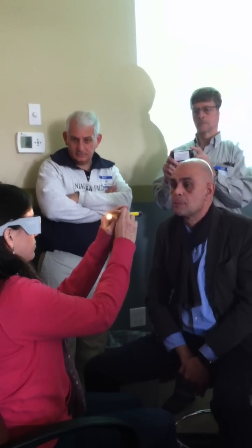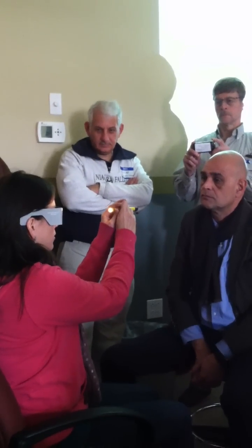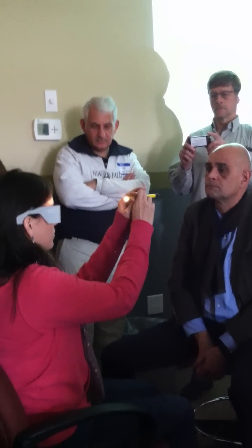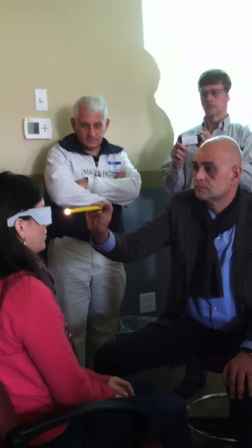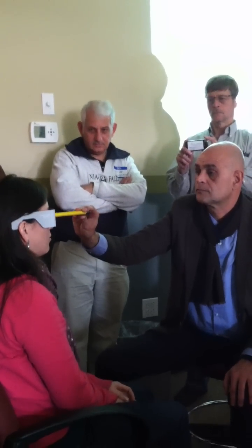Should I return to you? How is it for you? It's fine. I'll hold it. Can you see it? Yes. You still have one? Yes. Does it hurt? Yes. Does it hurt? No.